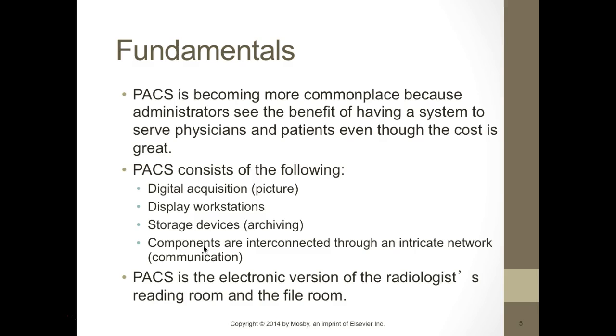So the fundamentals of PACS. All of you are familiar with the PACS systems. When I started in radiology, there was no PACS system. So it was film library, and we're going to talk about the differences between the film library and working in an environment that has a PACS system, and to see the difference in the workflow. So PACS is very common now, and they consist of a digital acquisition.